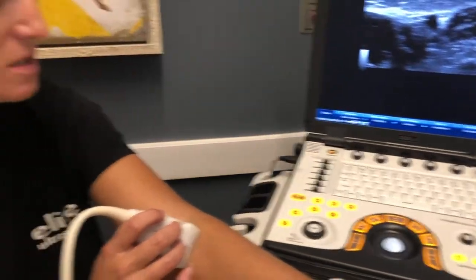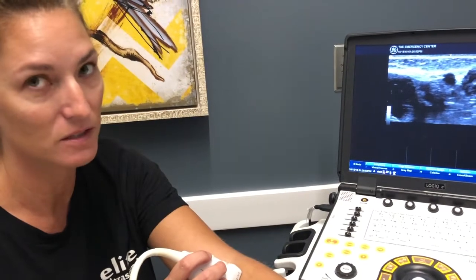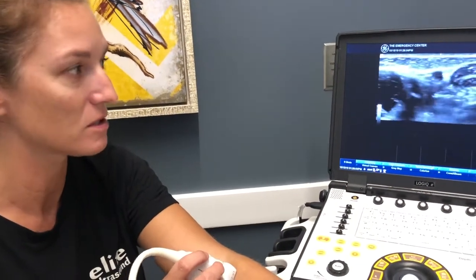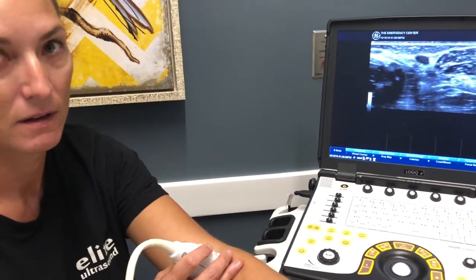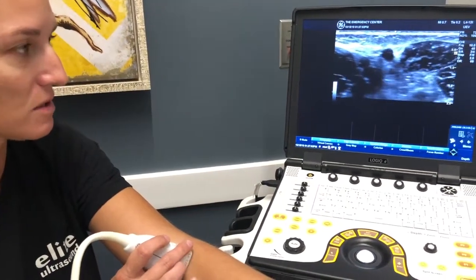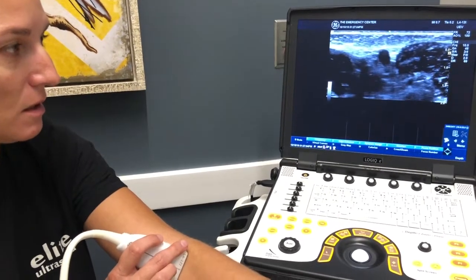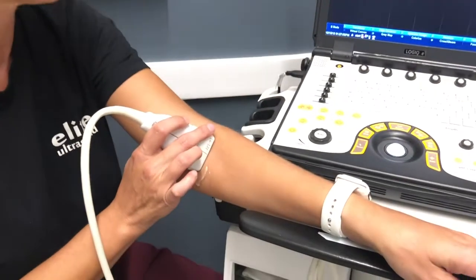The key is just a light touch, not to compress those vessels, because it's so easy to be holding it, trying to keep your probe still, and you're pressing that vessel closed. So just very, very light touch. Angle it back just a little bit so you can see.